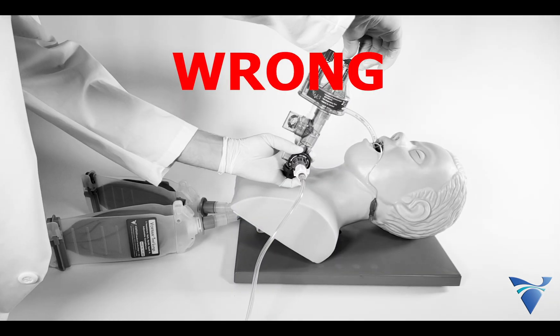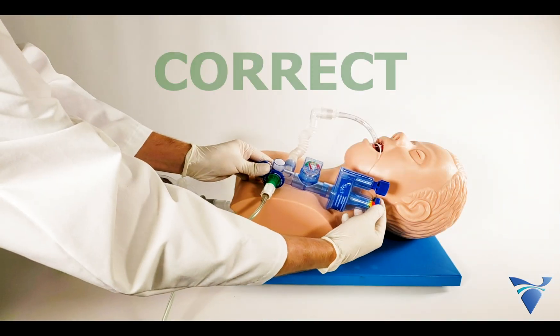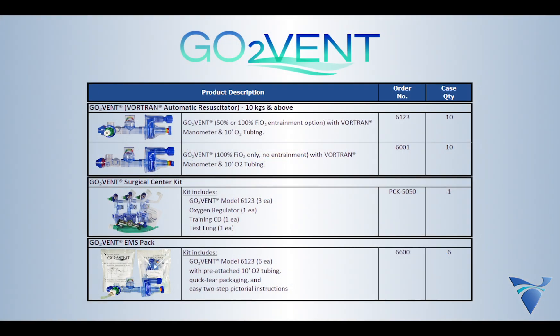Settings should always be verified when the GoToVent is in its final position after connection to the patient. Perform final adjustments on the control knobs as needed. The Vortran GoToVent is a cost-effective, safe, and easy means to manage your patient's ventilation.